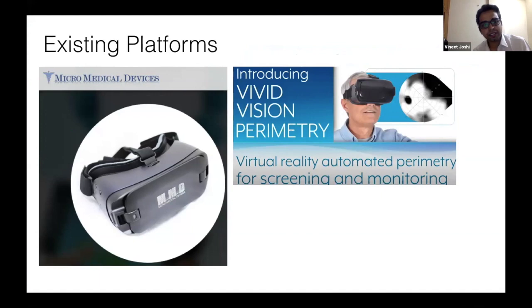There are many devices in the US and in Israel which have been launched to date, where they can perform a complete full thresholding, and they are very close to replacing the algorithms performed by the current gold standards. But the time is still a little far away. It needs a lot of correction, especially in the follow-up algorithms.